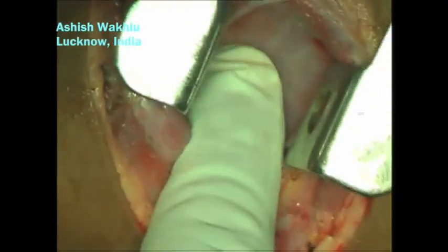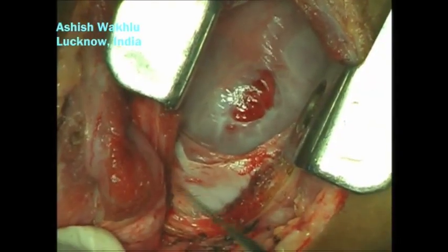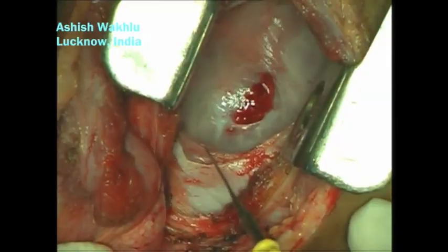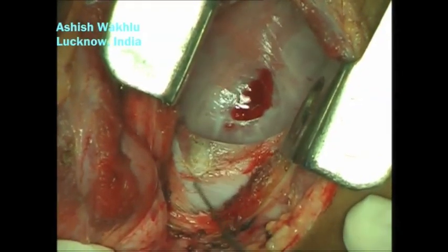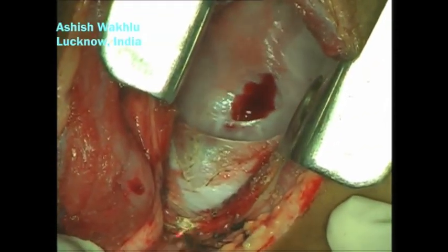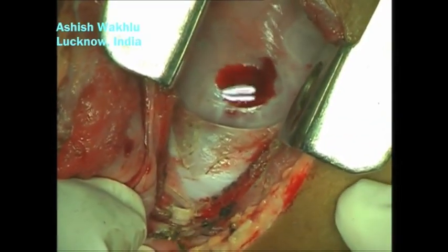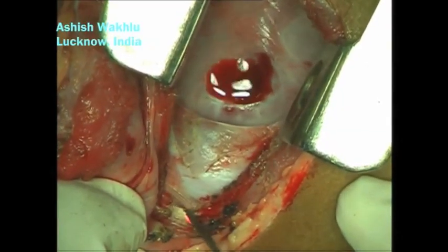As the Finochietto retractor is inserted and spread, we can see that the underlying lung is collapsed. There is a movement with respiration which is due to the diaphragmatic excursion. However, the lung is not getting aerated and is not expanding at all. Also, the color is grayish instead of the normal healthy pink.